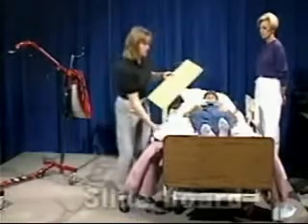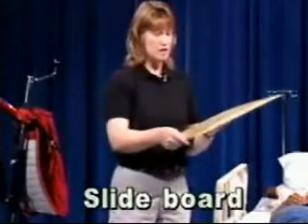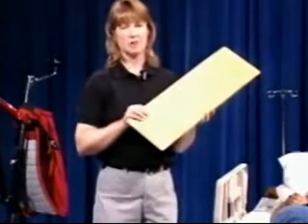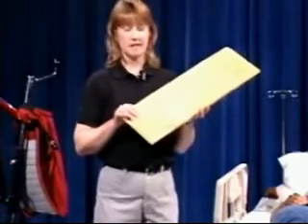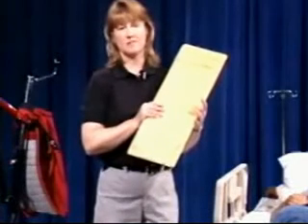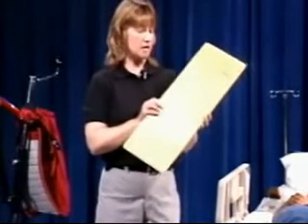This is called a slide board. Some people call it a transfer board. This one is made of wood. You can see that the ends of it are tapered. That just assists the patient in being able to get on and off it more easily. A transfer board sometimes is made of plastic. Sometimes they're longer or shorter, just depending on the patient's needs. Either way, they're used basically in the same way, and they all basically look the same.